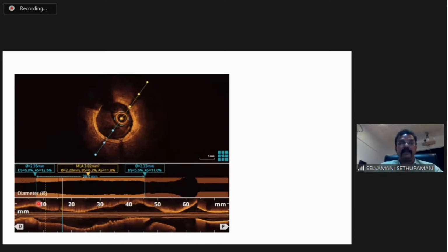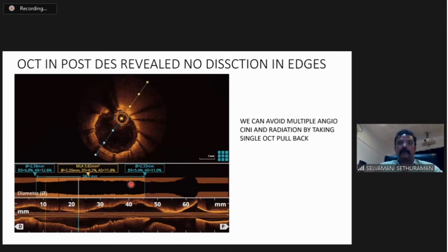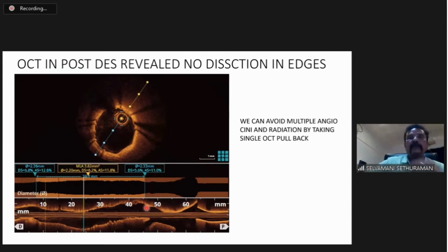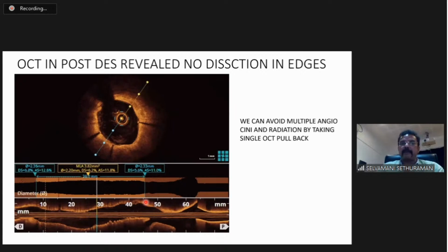And then you look at the stent expansion here. It is a well expanded stent. And you can look at the proximal area also when the run comes there. There is no dissection or thrombus. But probably for some reason, there is some haziness on the angiogram. Probably it is spasm, or a mismatch, you can call it something. But definitely imaging wise, there is no major problem.